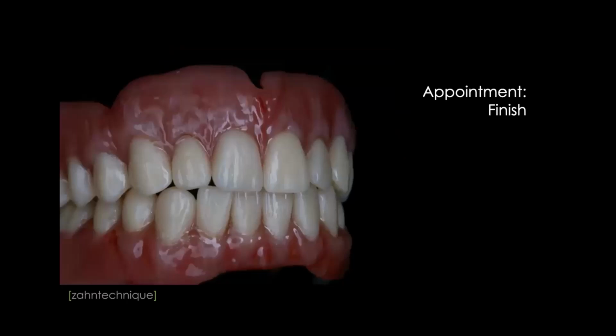In whatever material we decide to do together, that's going to be a decision you have to make with your patient, right? So now there are other kinds of workflows we really like, and I think are really amazing, especially in digital workflow: scan for a duplicate denture, or scan with an existing denture, especially the denture duplicate. Since we've been doing digital dentures, it blew completely up, right? I mean, that was crazy. When I think about how many duplicate dentures we did before digital, almost none. I know. It's like, we have to do duplicates. This is a lot of work.